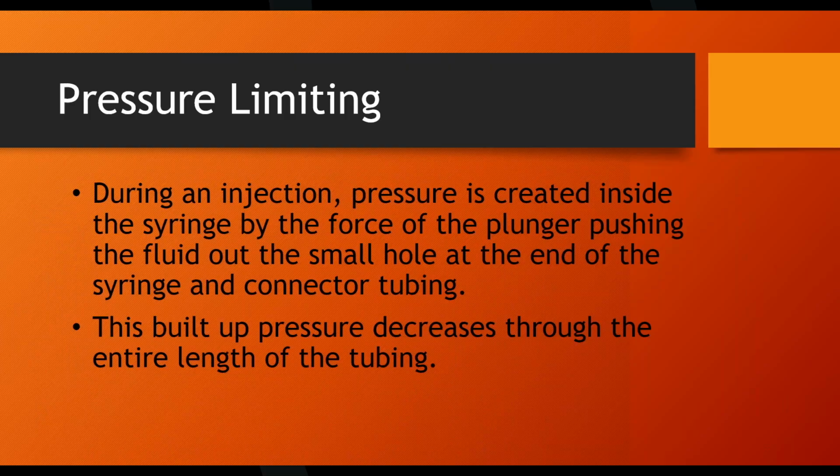I know some of you might not be able to see these numbers, but over here you see my 2 syringes, blue and green. The green is contrast, blue is saline, and this display shows you the volume in each. Then you see this line right here.